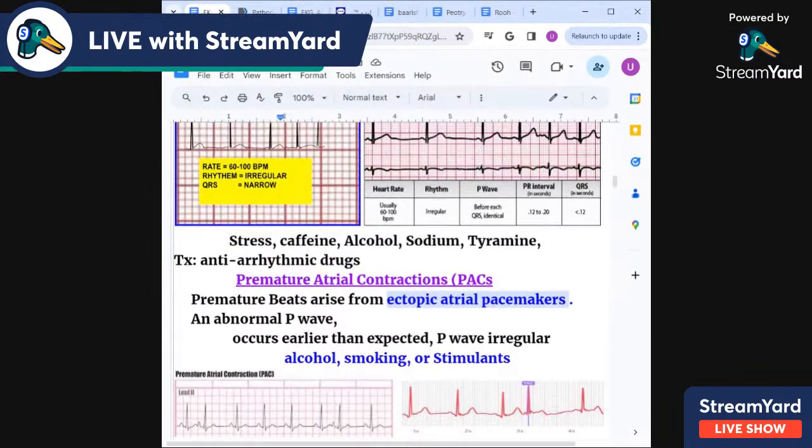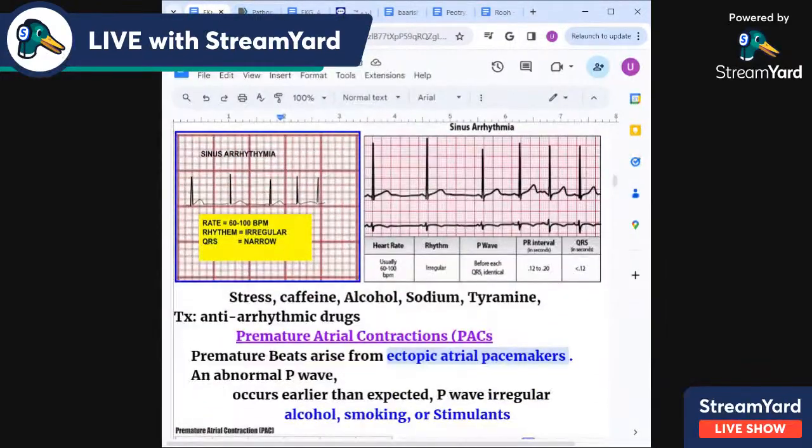And then why is it not coming over here on this? Okay, let's see. This page is not visible here. Oh, I see. I was on the wrong page.